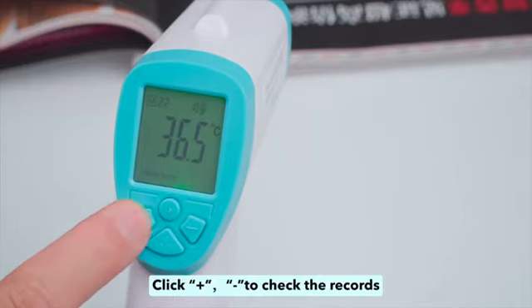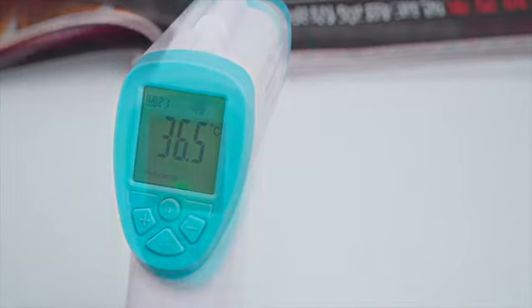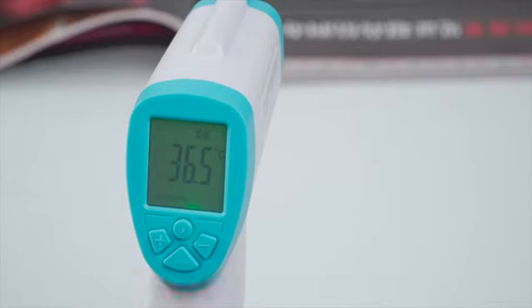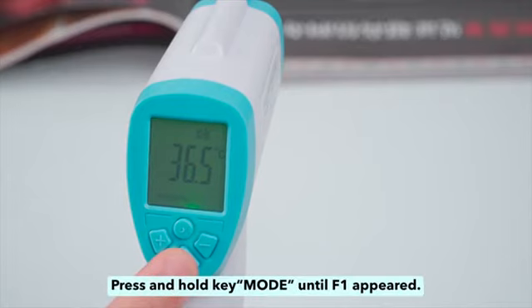Click plus or minus to check the records. Click key mode to set the sound on or off. Press and hold key mode until F1 appears.